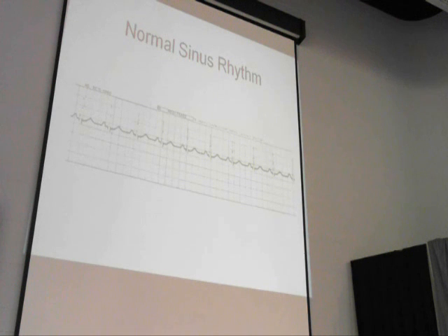And then it's only fair that the atrial compartments have a time frame. It's only fair that the ventricles have their time frame as well. For the ventricles to depolarize, you're also looking at the QRS complex, 0.04 up to 0.12 seconds. That's in Mr. Rogers' neighborhood of cardiology. Everything is normal. Our electrolyte levels are normal. The conduction system is working like it should.